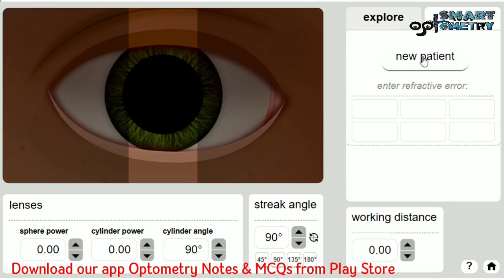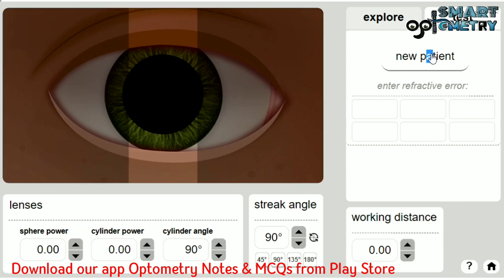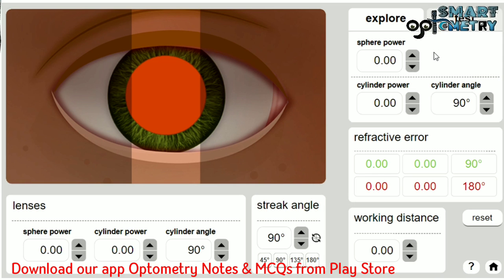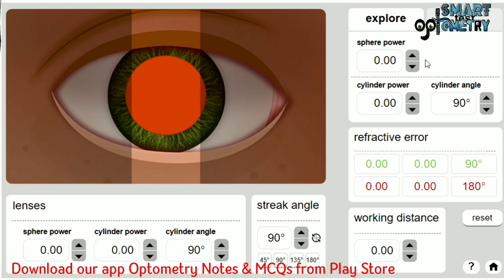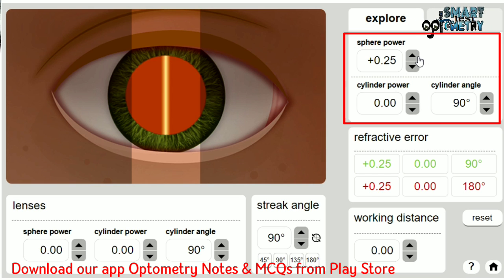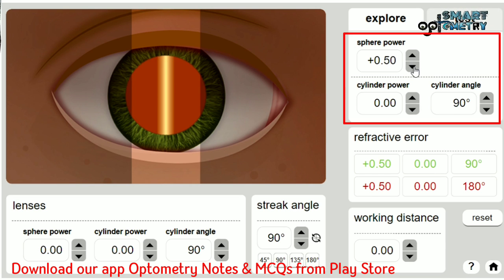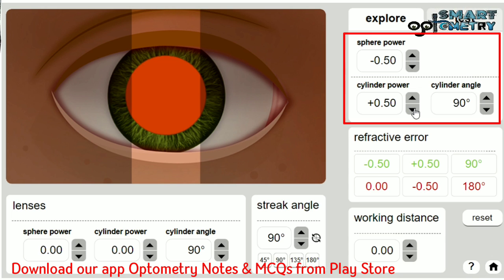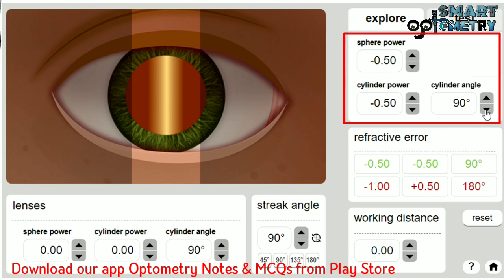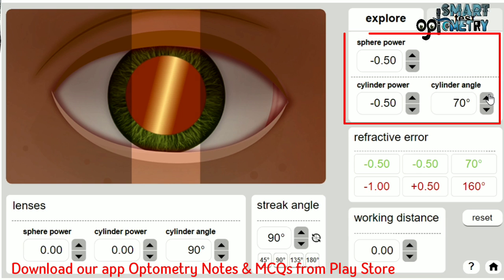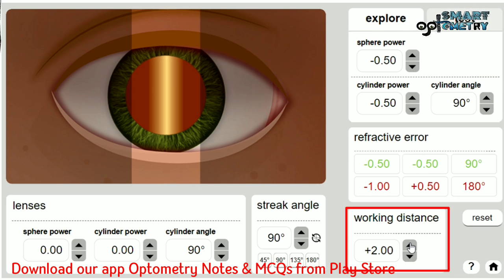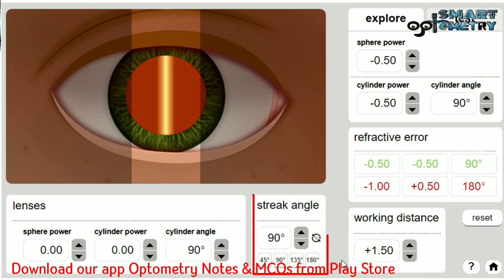In explore mode, you can choose the refractive error of the patient manually. If you click the top button it will give plus power trial lenses, and if you click the bottom button it will give minus trial lenses — this applies for both spherical as well as cylinder.